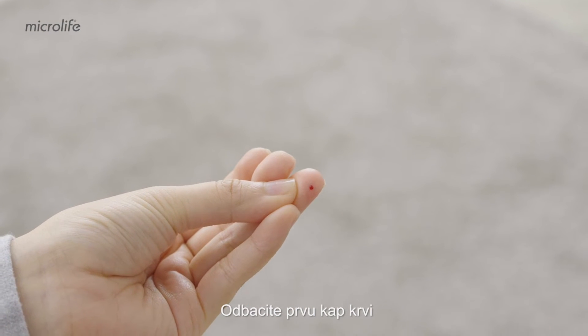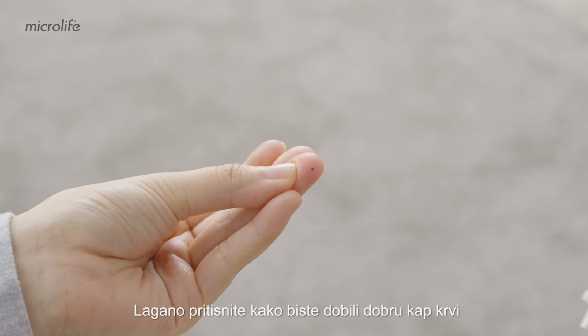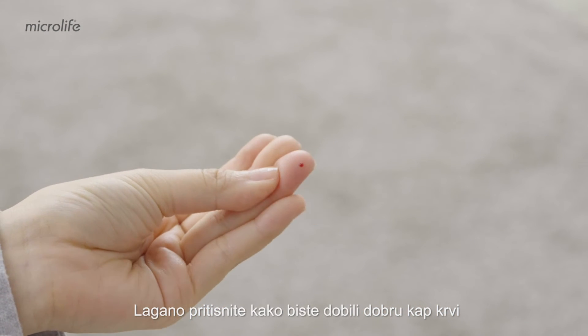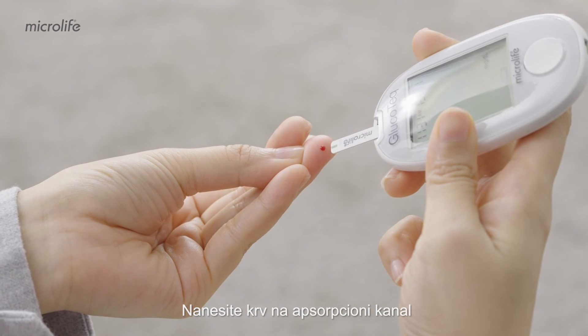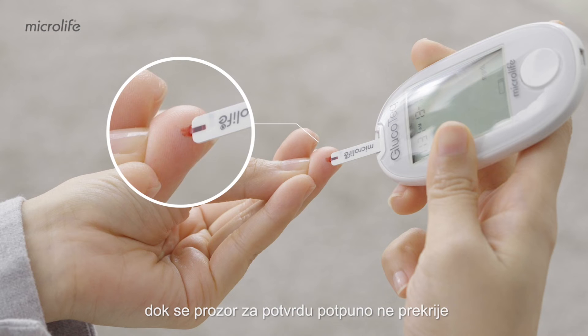Discard the first drop of blood. Give a little squeeze to get a good drop of blood. Apply blood to the absorbent channel until the confirmation window is completely covered.